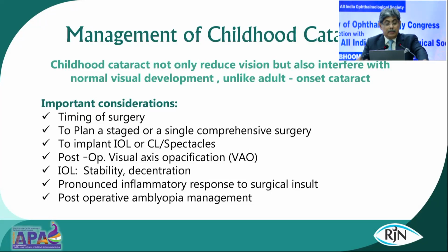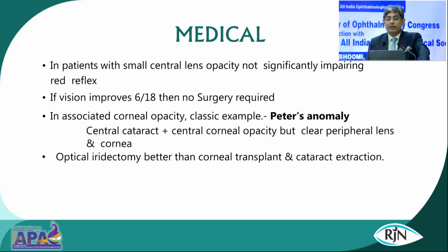Stability of the IOL is also a concern, with a high chance of decentration because of the excessive fibrosis. There is a pronounced inflammatory response to the surgical insult. Post-operative amblyopia management should also be kept in mind in all these patients after the surgery.